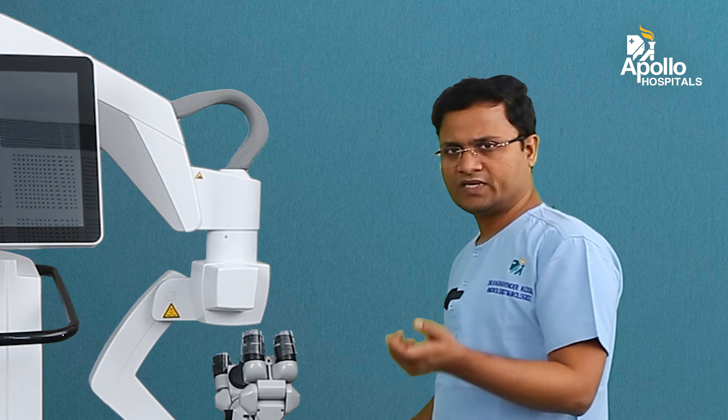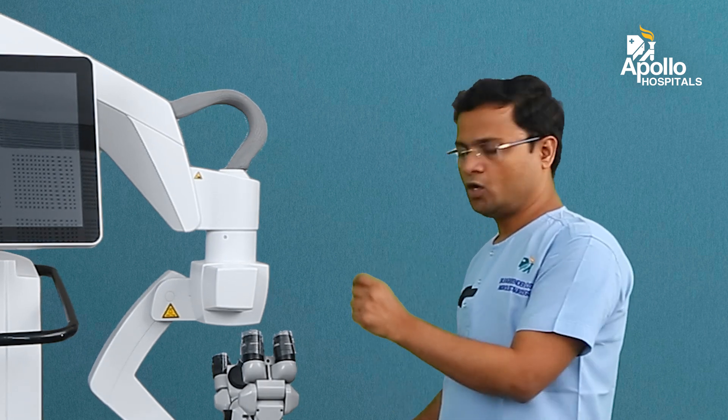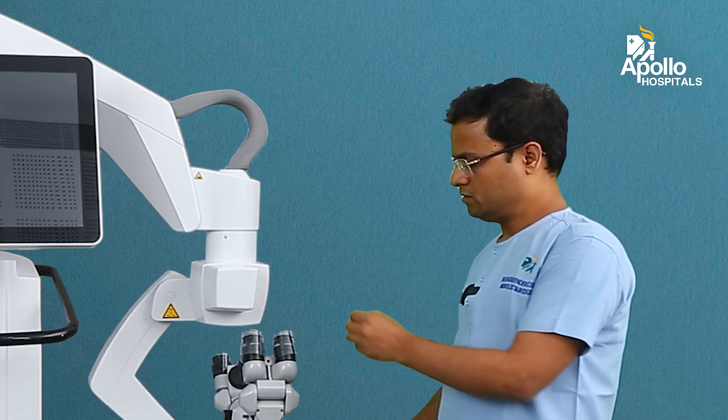This will enhance our surgical results because our precision will be better while operating using this microscope.